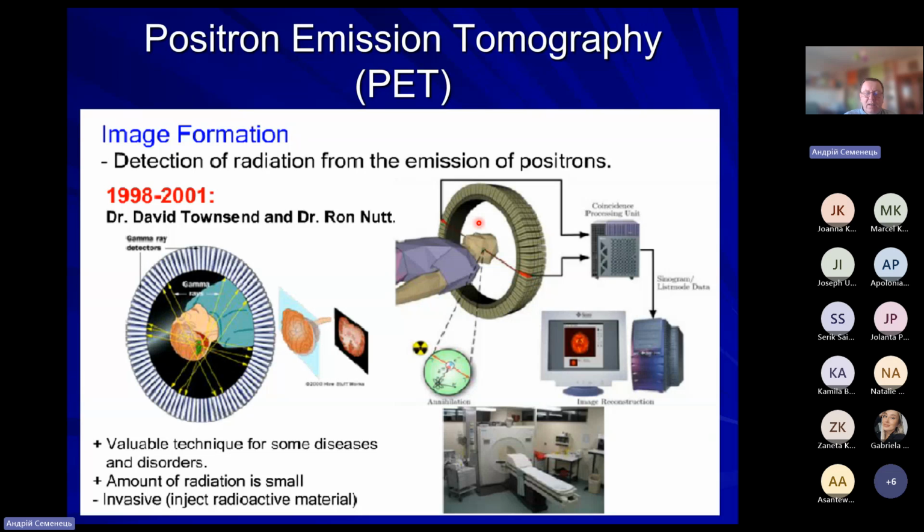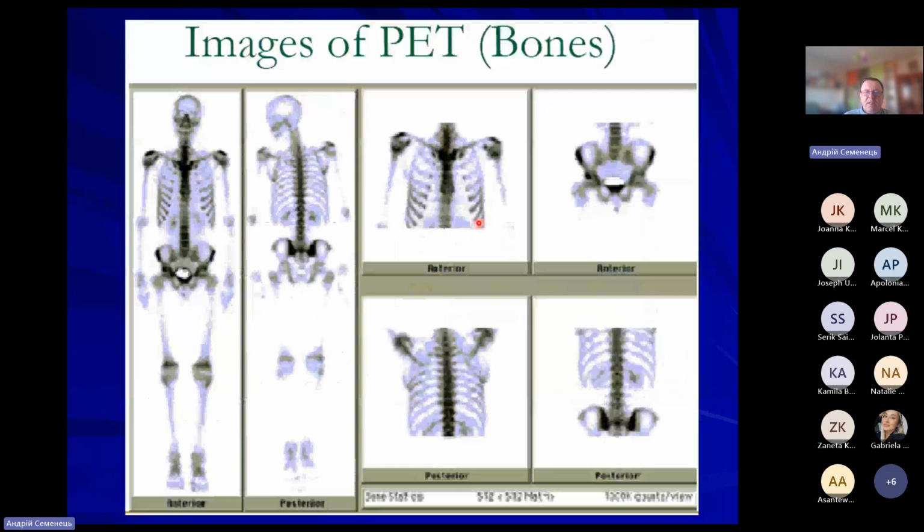Again, we have quite a significant difference in physical principles, in how we have to register the radiation emission, but again, the approach to image reconstruction is the same as in the case of CT.